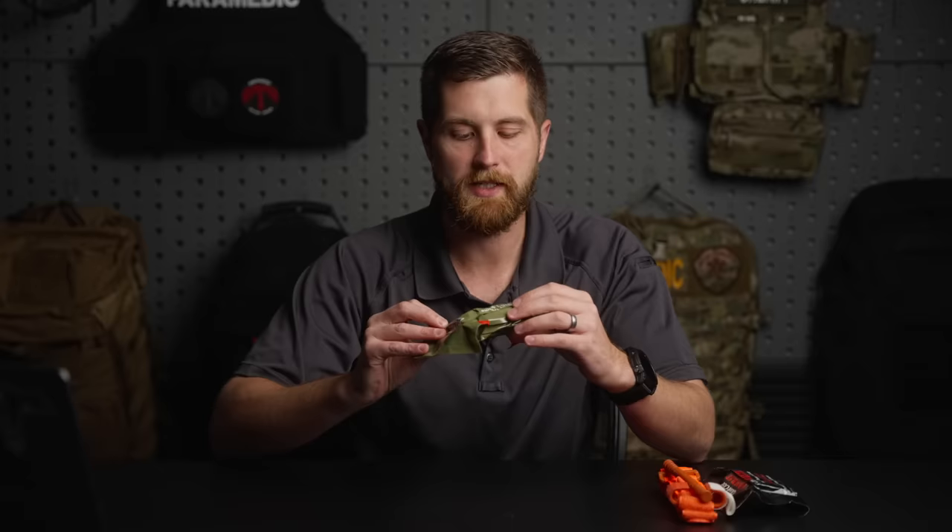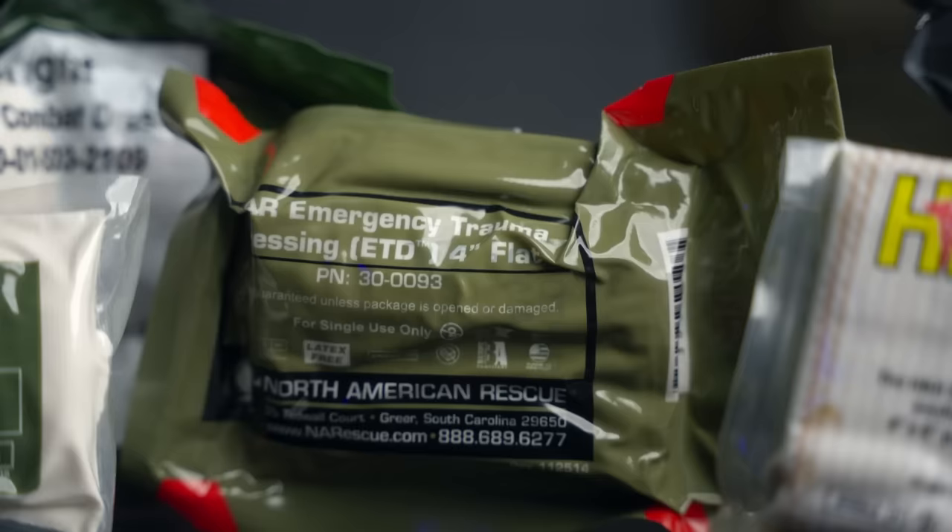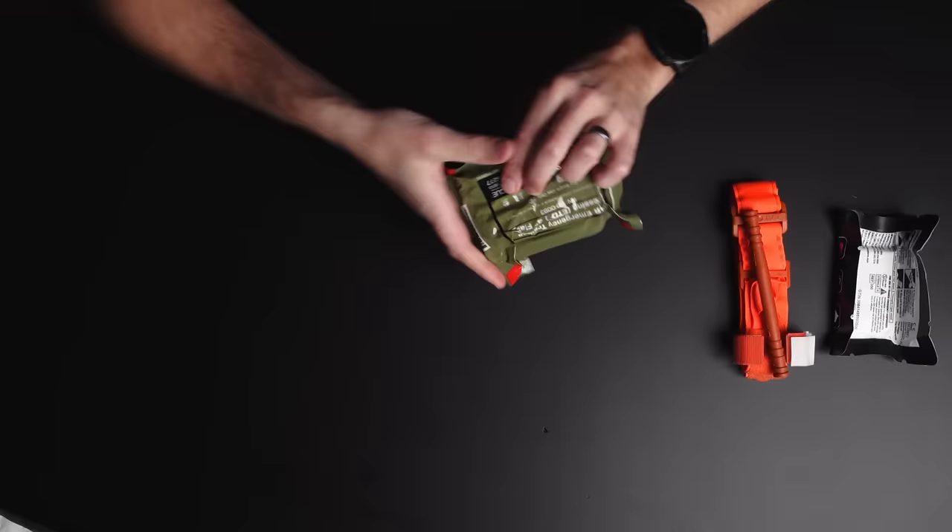So now we have two items for major extremity bleeding. The next thing we're going to throw in there is some kind of pressure dressing. This is a NAR emergency trauma dressing — tons on the market and they're all great, they all work excellent. Just find one that has a form factor you want. This runs about $9 on Medical Gear Outfitters. It's just a wrap for anything — you can wrap a junctional site, a head wound, or an arm wound with bad bleeding that's not quite life-threatening.